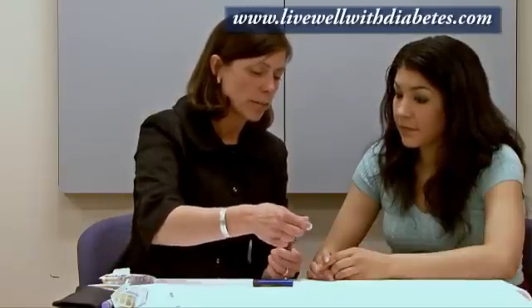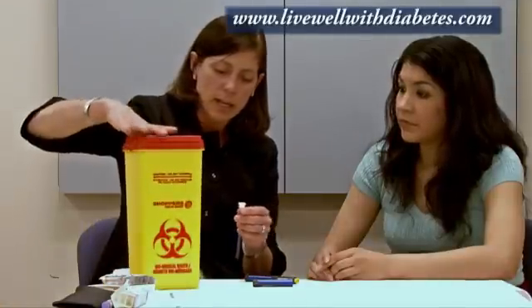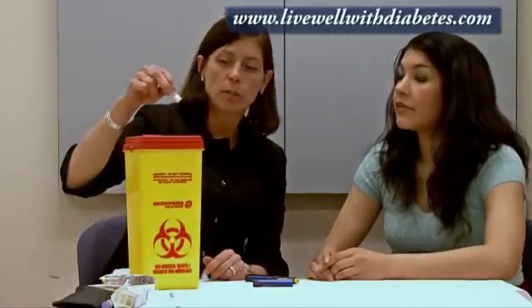The needle is meant to be used once only. After use, take the outside plastic cap, put it over top, and unscrew the needle. There are two safe ways to dispose of used needles: one is a sharps disposal device from the pharmacy — pharmacies will take these back and give you a new one when it's full. The second safe method is an old coffee tin or plastic container; fill it with used needles, put the lid on, tape it shut, and throw it in the garbage.